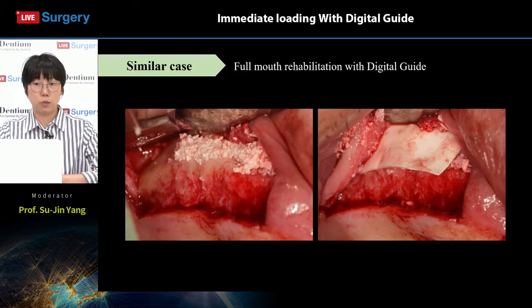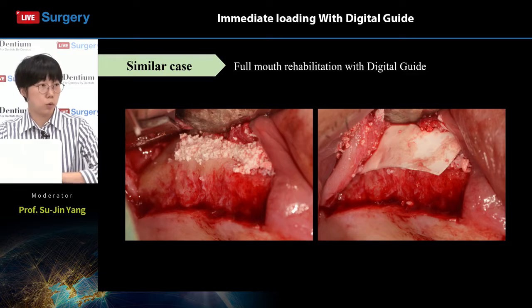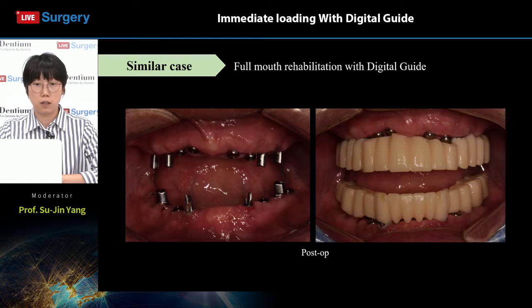Lateral sinus augmentation was done on both sides using materials from Dentium. That was probably an osteone and a membrane 1 or 2. And after some amount of healing, full mouth implant placement was done. Implants were placed in the upper right and left edentulous areas with extensive bone graft and soft tissue graft in the upper right canine area. Immediate provisionalization was performed on the same day. The temporary bridges were delivered with minimal occlusal adjustments.